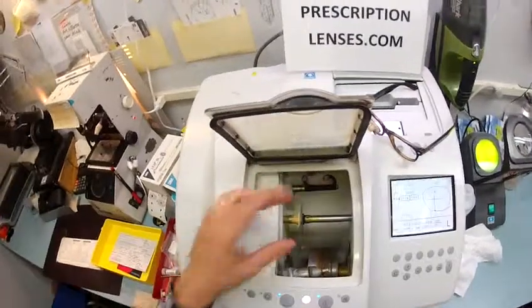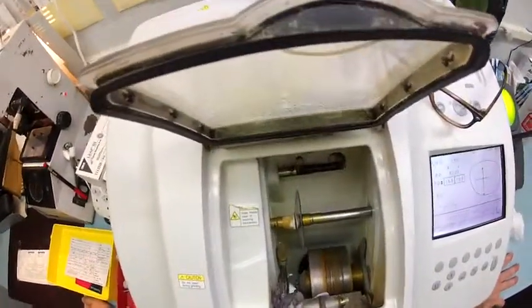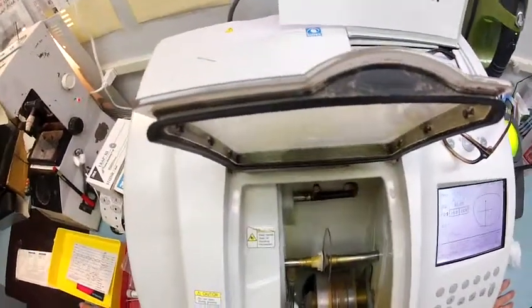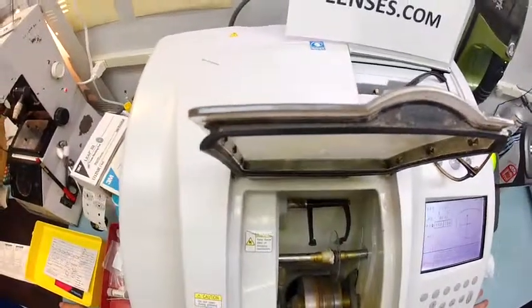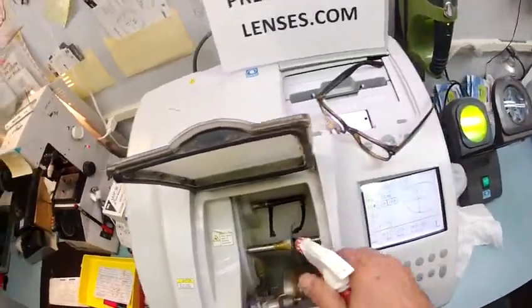So I'm going to flip this over to the left, and we're going to do the same thing, except this time it's going to trace the shape of your left lens. Just like before, starting with the concave side first, closest to your eyelashes, then it's going to move over and trace the convex side, all the while using those calipers to measure the thickness, so it knows exactly where to place the bevel. I'm just going to clean that sawdust off right there.